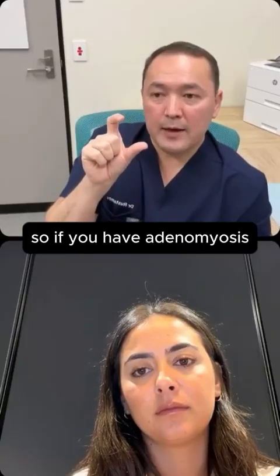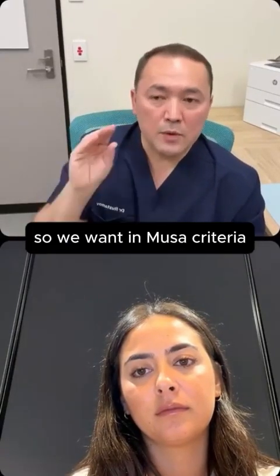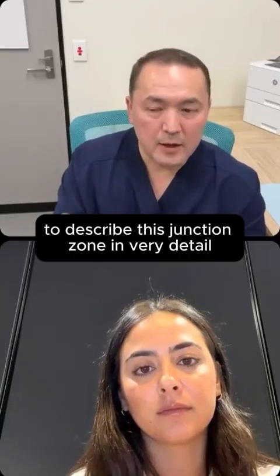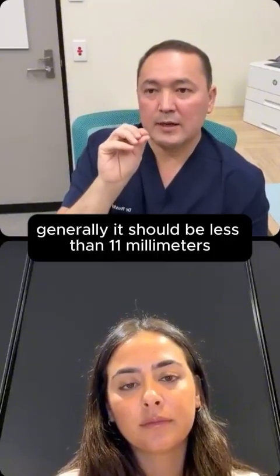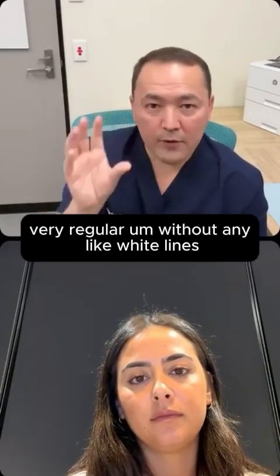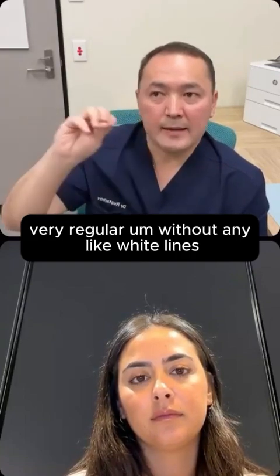So if you have adenomyosis, usually you have a problem in that junctional zone. So we want, in MUSE criteria, sonographers to describe this junctional zone in very great detail. Normally the junctional zone should be very thin. Generally it should be less than 11 millimeters. And also it should be very smooth, very regular, without any white lines.